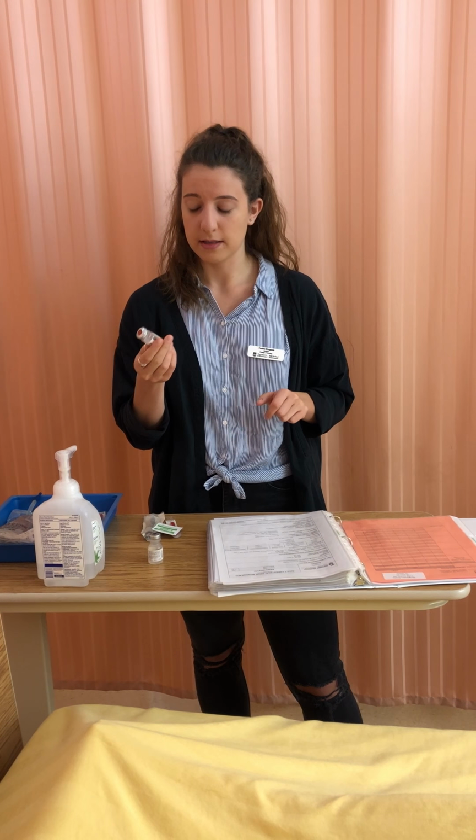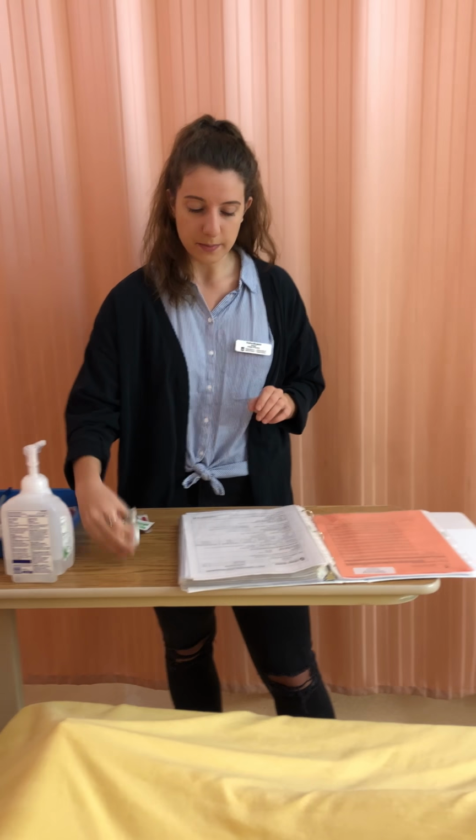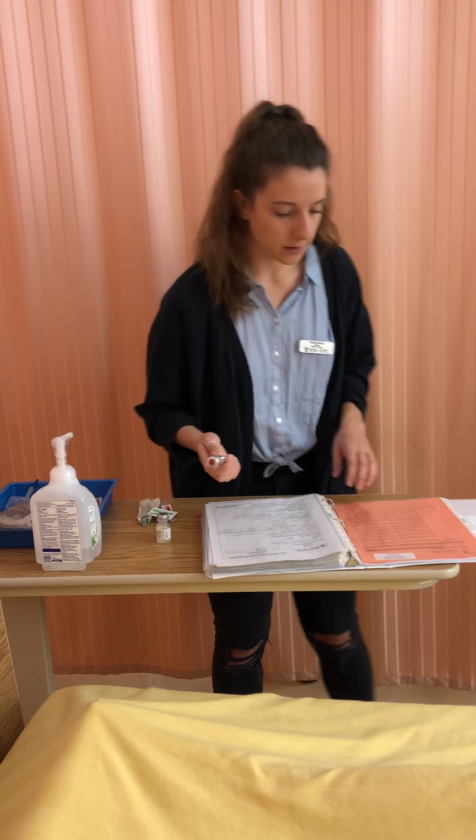I've taken my medication from Pyxis. The vial is not expired. The integrity is good, so I can use it. Also grabbed my reconstitution sterile water. It's also not expired, and the integrity is good. So I'm just gonna go ahead and do my first check.